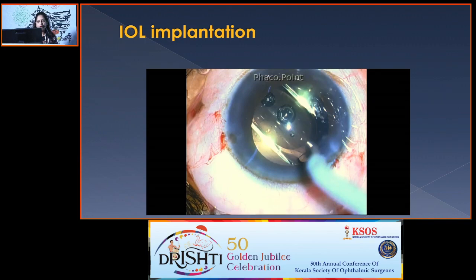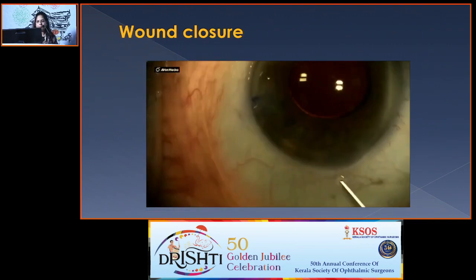While inserting, always use the dialer as a second instrument to assist because there is a chance of IOL flip. The leading haptic should go into the bag and gently dial the trailing haptic.